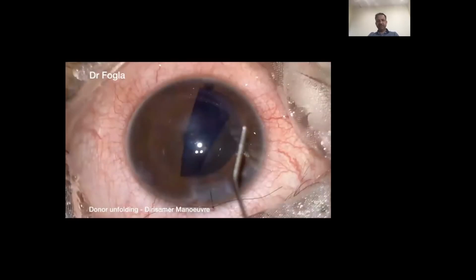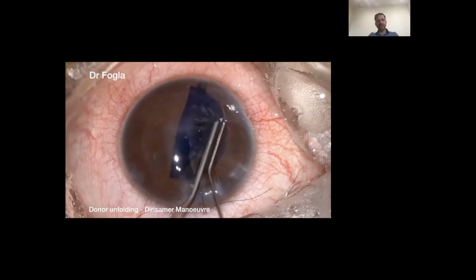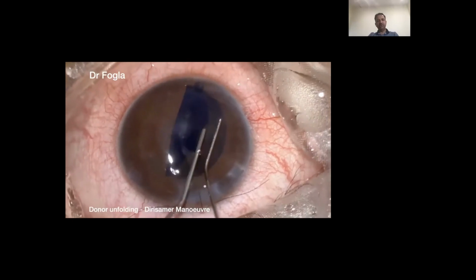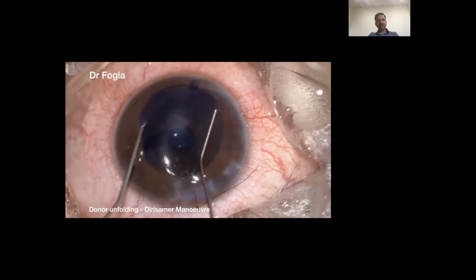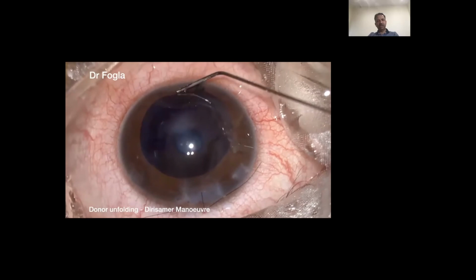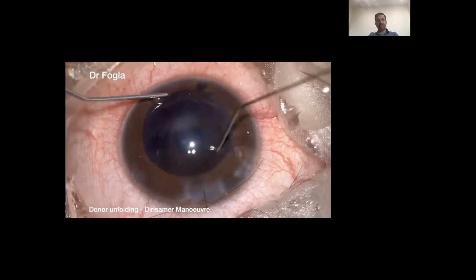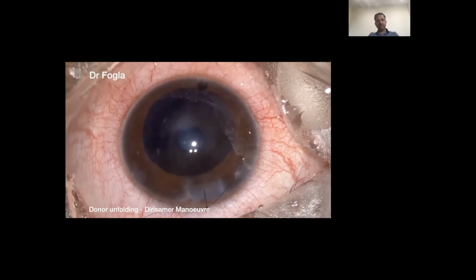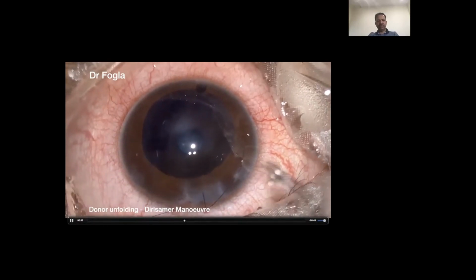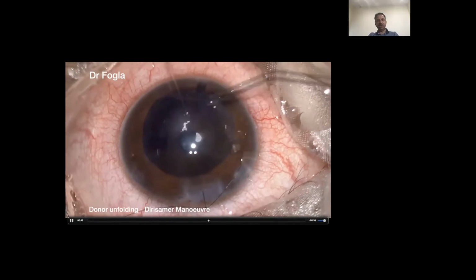If you have a tissue that's in this configuration, the other way is to use the Dirisamer maneuver, where you fixate one edge of the tissue with one cannula, and the other one you use like a drum roll or a carpet unrolling maneuver, where you can unfold by tapping the cornea, just inner to the tissue fold, and then unfold. Unlike a DSEK graft where you use golf strokes to move the tissue, here we just tap in the periphery outside the donor graft to get it into the desired position. Again, you will see that before we inject the air, we will always do a little bit of injection of fluid just to push the iris back, and then we go and inject the air bubble.